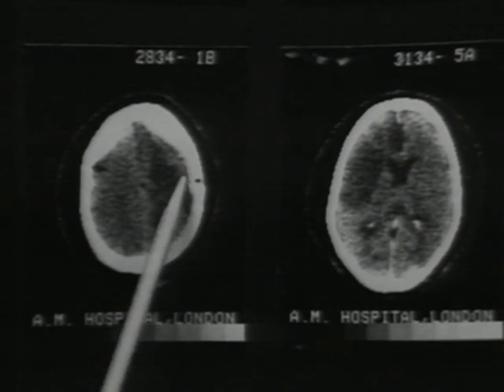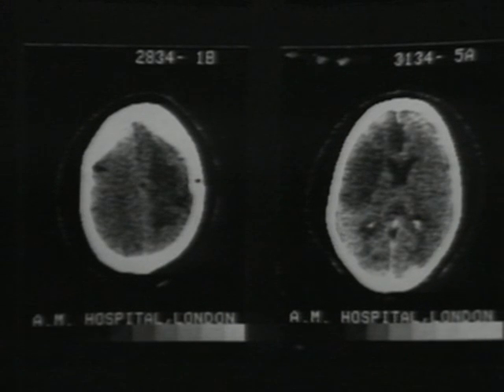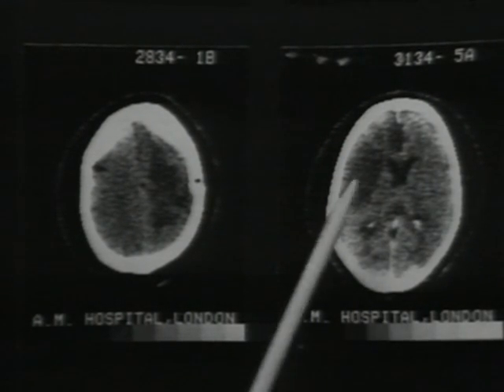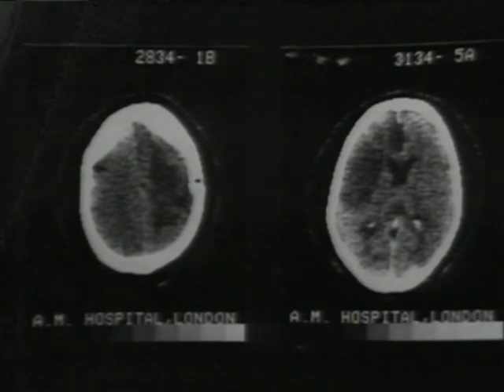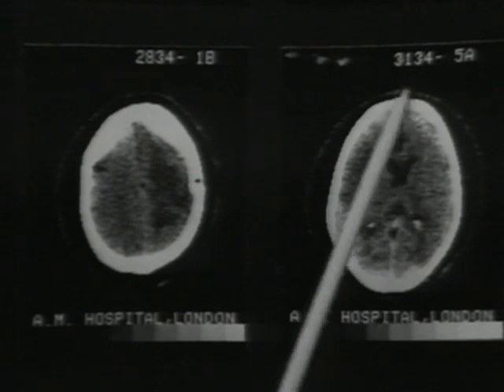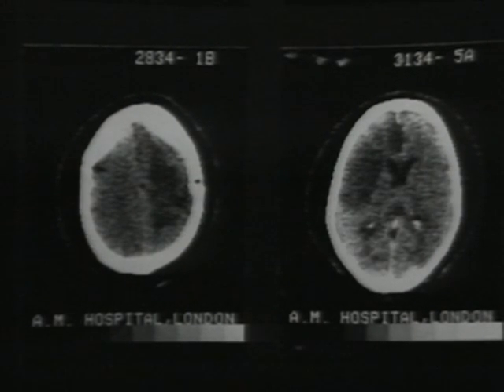And the EMI scan was in fact showing the edema. We can't actually see the abscess cavity itself, but I'll come back to this particular patient later on. In the next scan, we see a very similar appearance, this time affecting the left frontal lobe, but without much displacement of the ventricular system. And again, we require to know a little bit more about the patient.